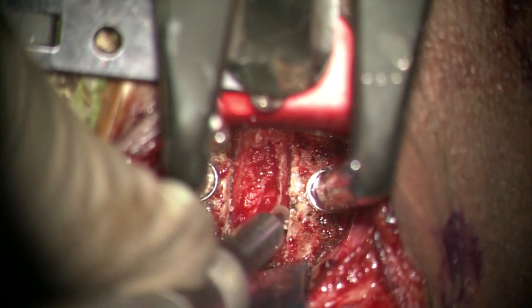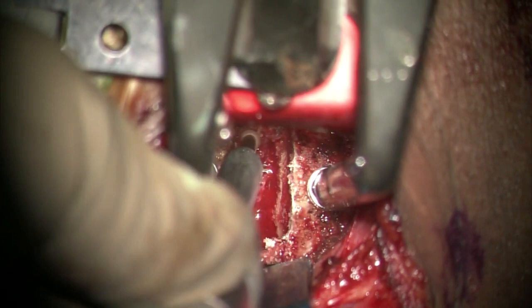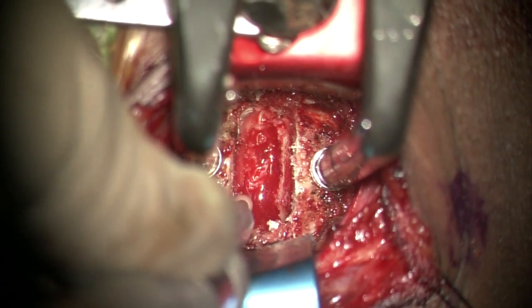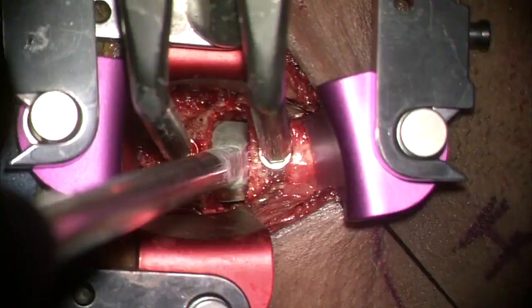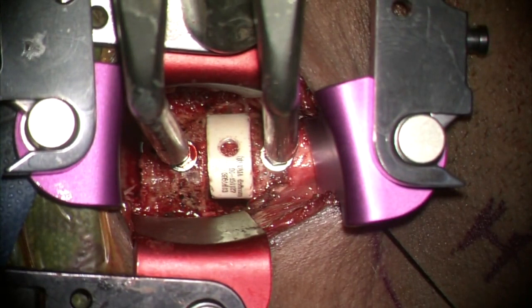The end plates are decorticated using a 3mm coarse diamond burr or a curette, with the ultimate aim of flattening the smile-shaped disc space and converting it into a rectangular box. Osteophytes, if found, can be removed at this stage. A sizer is used to determine the graft or cage size, and the distraction on the Casper pins should be released to assess the fit. A cage or graft of the same size as the sizer can then be gently hammered into place.